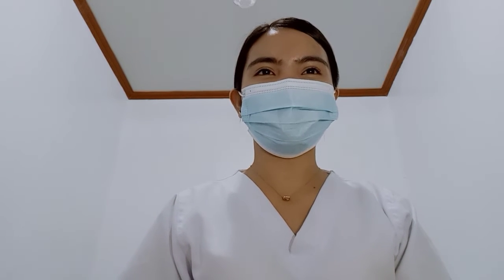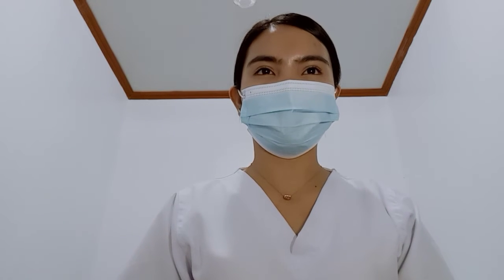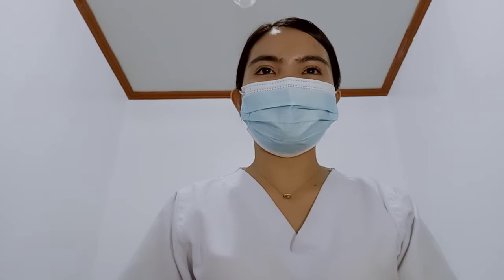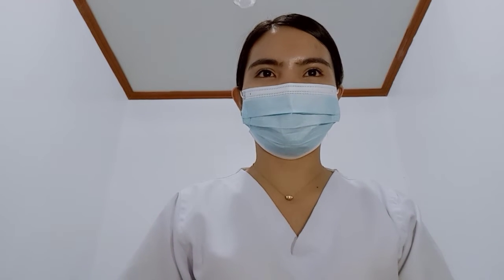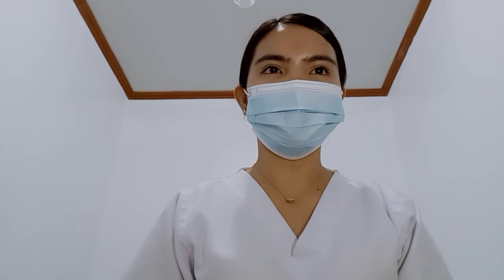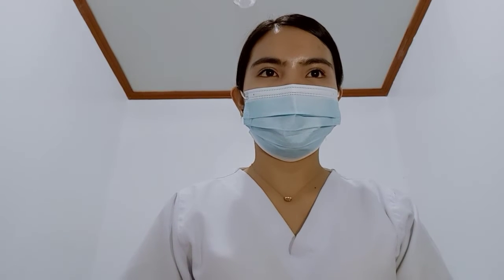Today I'll be demonstrating vital signs, which include the temperature, pulse, respiration, and blood pressure. First, let's define vital signs, which is a procedure that provides data that reflect the status of several body systems that include the cardiovascular, neurologic, peripheral vascular, and respiratory systems. The signs of basic physiology are reflected in body temperature, pulse, respiration, and blood pressure.